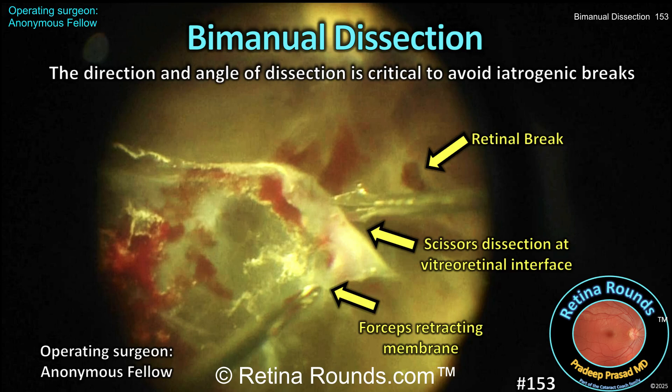Retina Rounds, episode number 153. Bimanual dissection is an efficient and effective surgical technique to dissect fibrovascular membranes off the retinal surface.